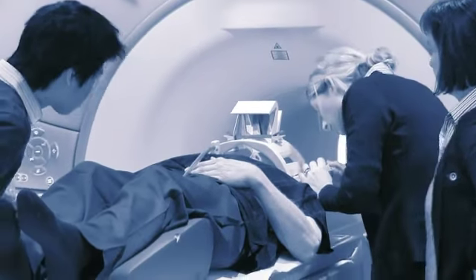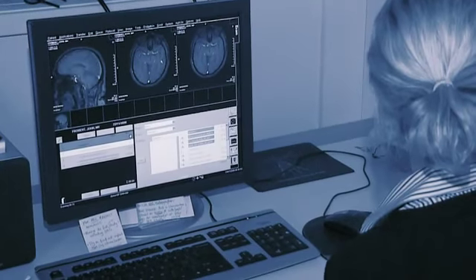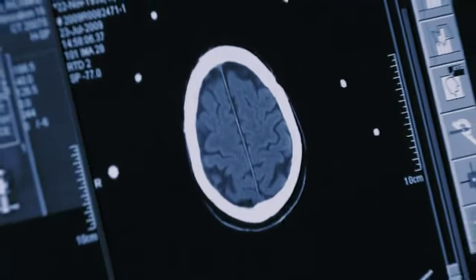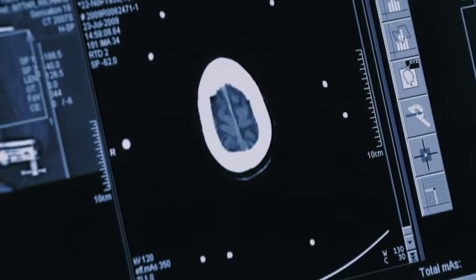Our ability to target areas in the brain has increased dramatically over the past few years with better quality MRI scanning. We can see these structures that we used to have to imagine where they might have been. We used to have to take measurements from certain more obvious structures in the brain and really hazard an educated guess as to where we should put the electrode. With better imaging, we can now see some of these areas, and we can pick not only the target, but exactly whereabouts in that target we want the electrode to sit.